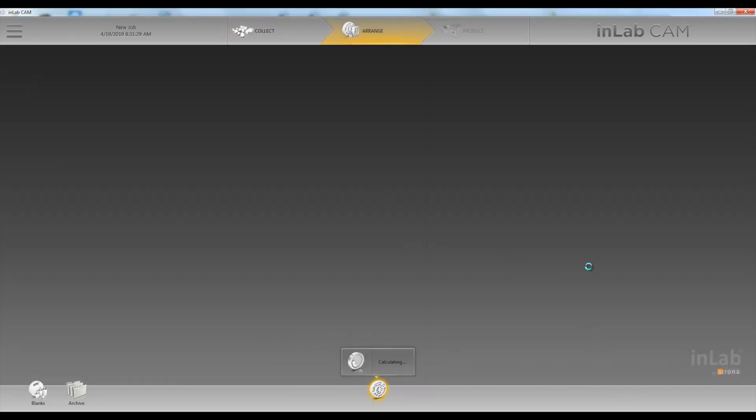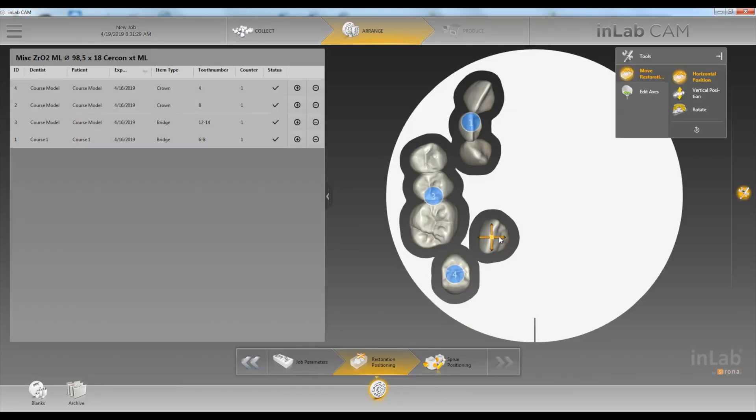The solver is going to propose the crowns in the disc for you. Now you can move them wherever you want. First we'll move them horizontally.